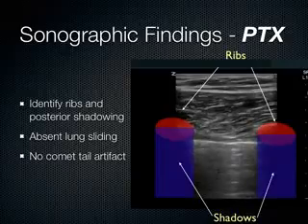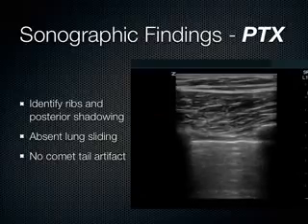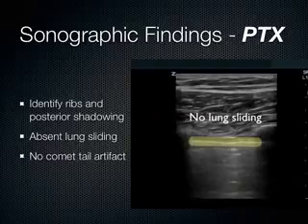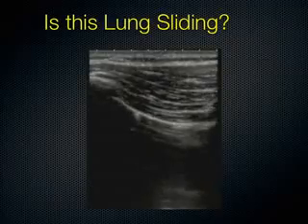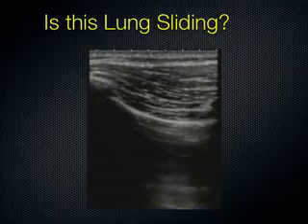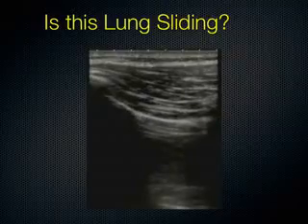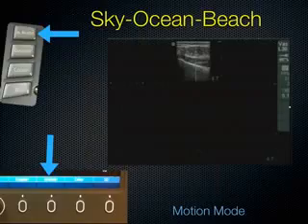Moving on. Just a couple examples. Is this lung sliding? So, pneumothorax or not? No. Good. You're experts now. That's really all you need to know. How difficult is it to get that image? Very easy to get the image. You will all be flying through this and then looking at kidneys and hearts later today because it's very easy to get the image. So we're moving on to the M mode.